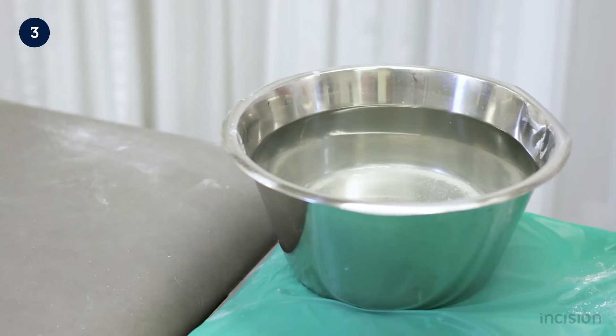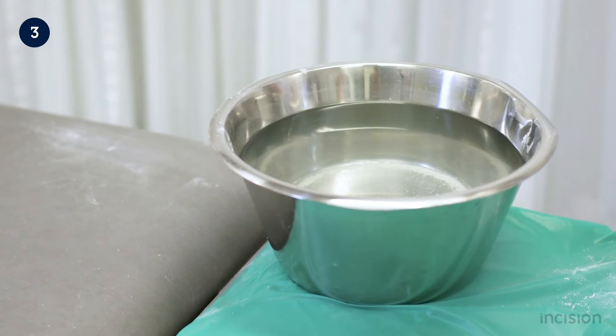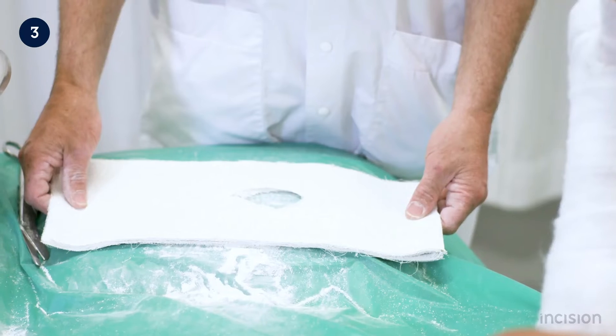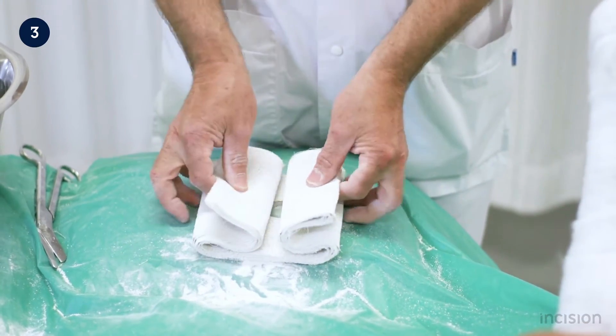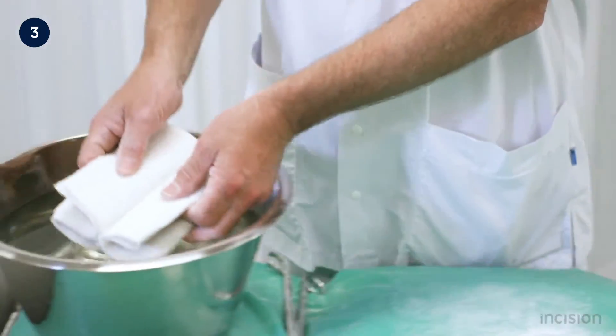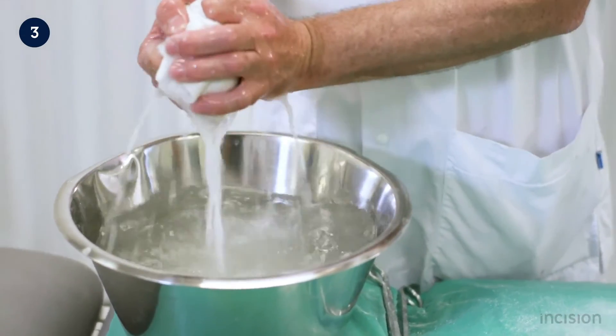Water at room temperature is used to wet the plaster, as too hot water causes the plaster to harden too quickly. The plaster is folded in a corrugated fashion and then dipped in the water for a few seconds. Excess water is then squeezed from the plaster.